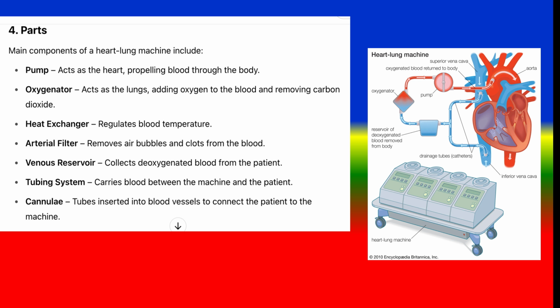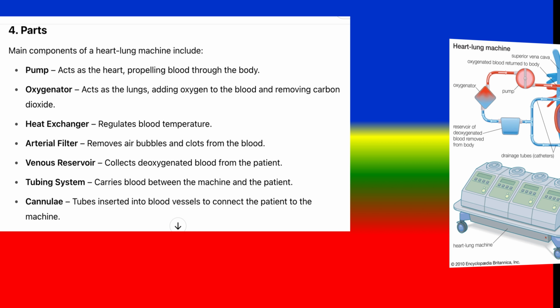Venous reservoir, which collects deoxygenated blood from the patient. Tubing system, which carries blood between the machine and the patient. Cannulae, tubes inserted into blood vessels to connect the patient to the machine.